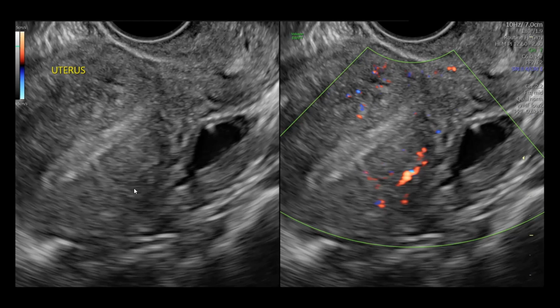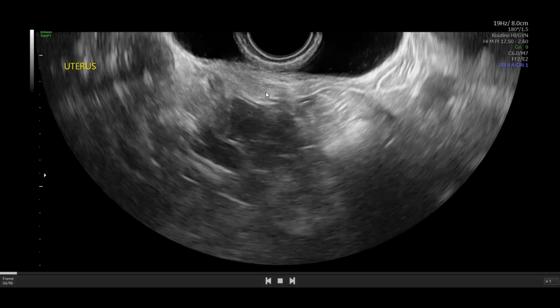A tip is that at the periphery of the myometrium is where you're going to find the arcuate vessels, and so it's less likely for you to find focal myometrial cysts in that area. Quite possibly if there's deep endometriosis and focal adenomyosis of the outer myometrium, you may, but that's usually a little bit more hypoechoic, almost fibrotic in nature, rather than that more true original adenomyosis that stems from the junctional zone.